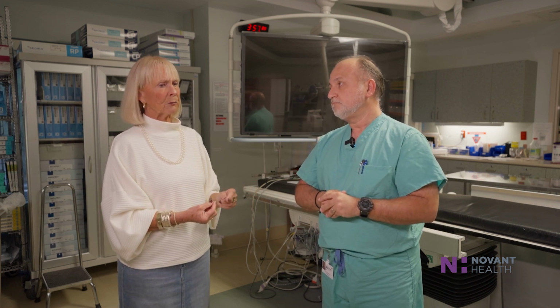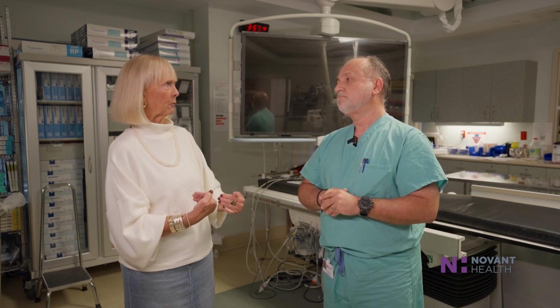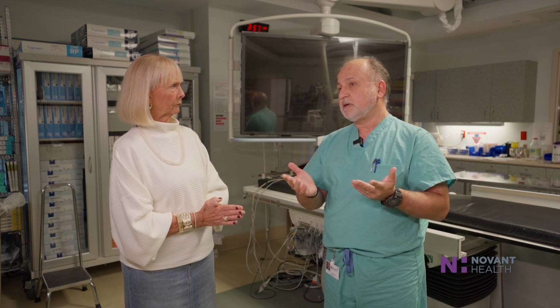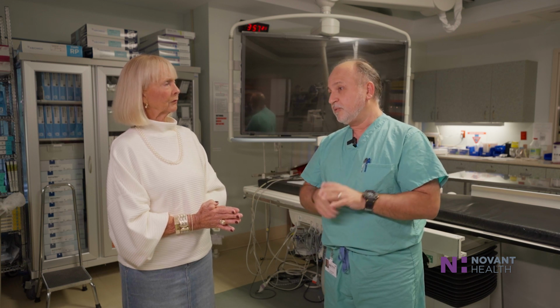So I know we've only got a couple of minutes. So we've decided on this Watchman procedure. What will I experience when I am having that procedure? Well, hopefully what you experience is you talk to us, we're telling you that we give you some sedation, and then you wake up and we're done. We hope that that's really the case.